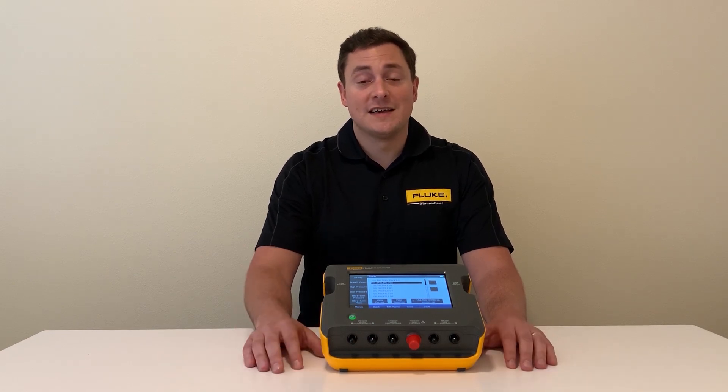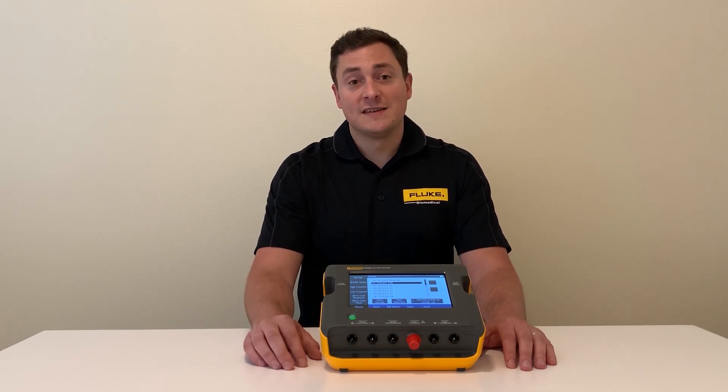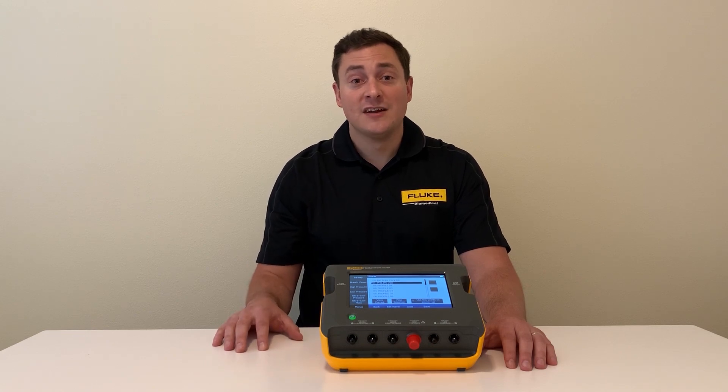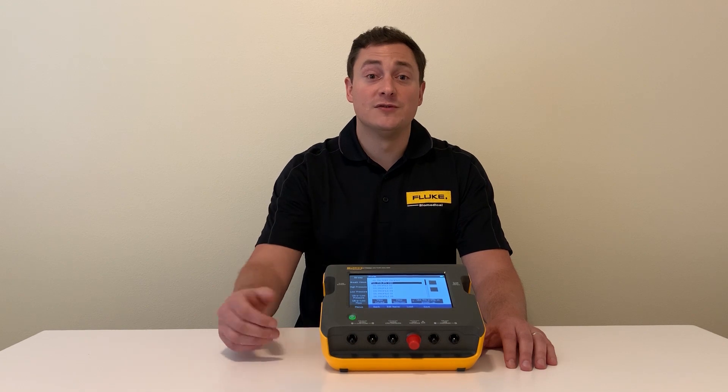If you need a more advanced test procedure, we have oneQA workflow automation software. This allows you to customize your checkout procedure to the brand and model of ventilator, and even put pictures in there to show test setup for those who are new to the task.